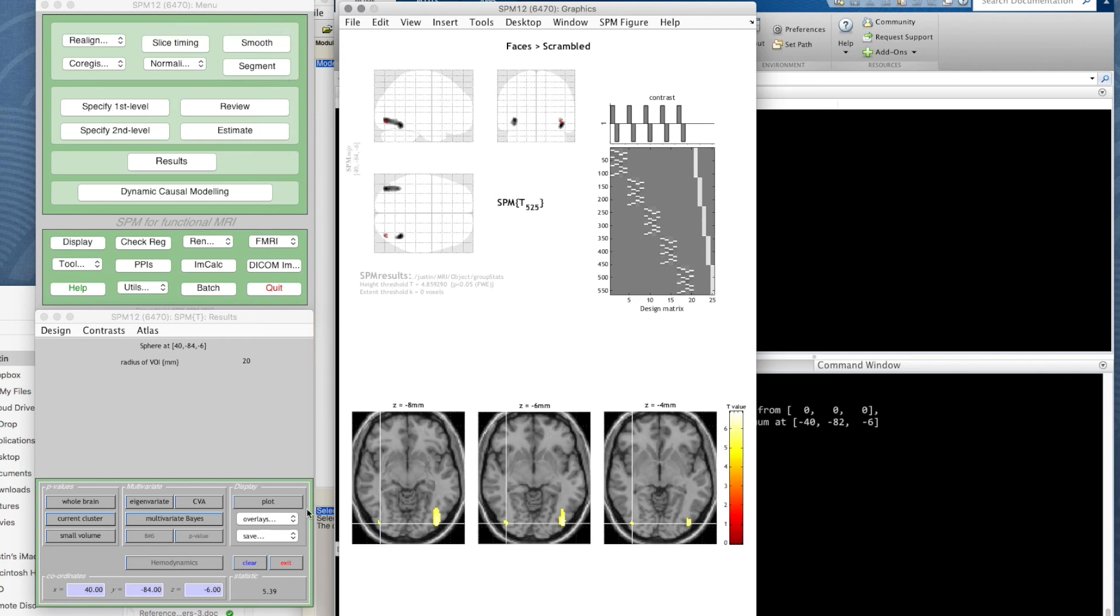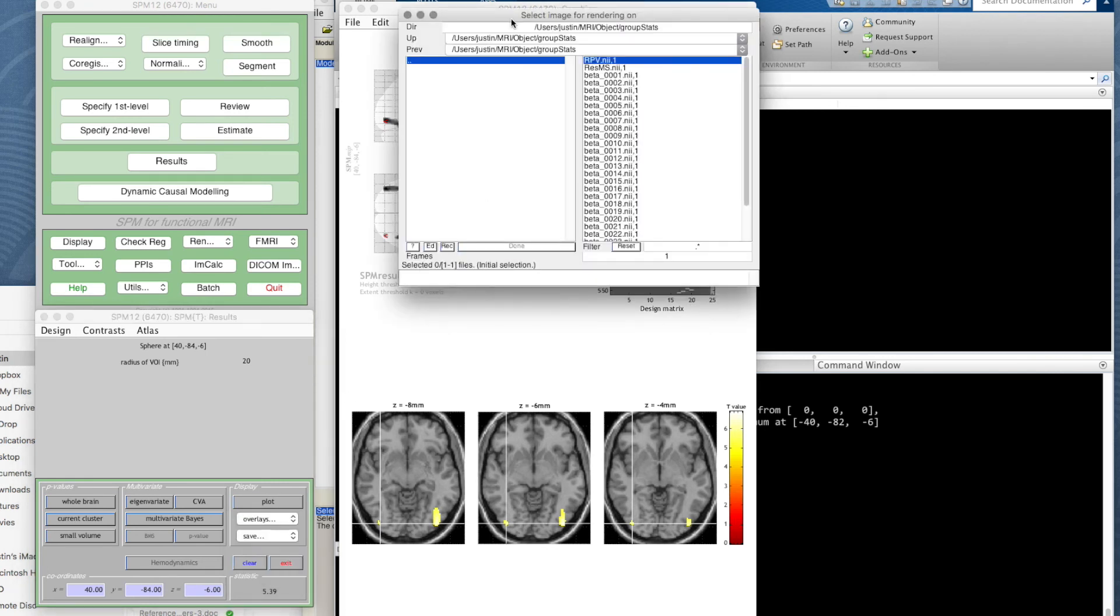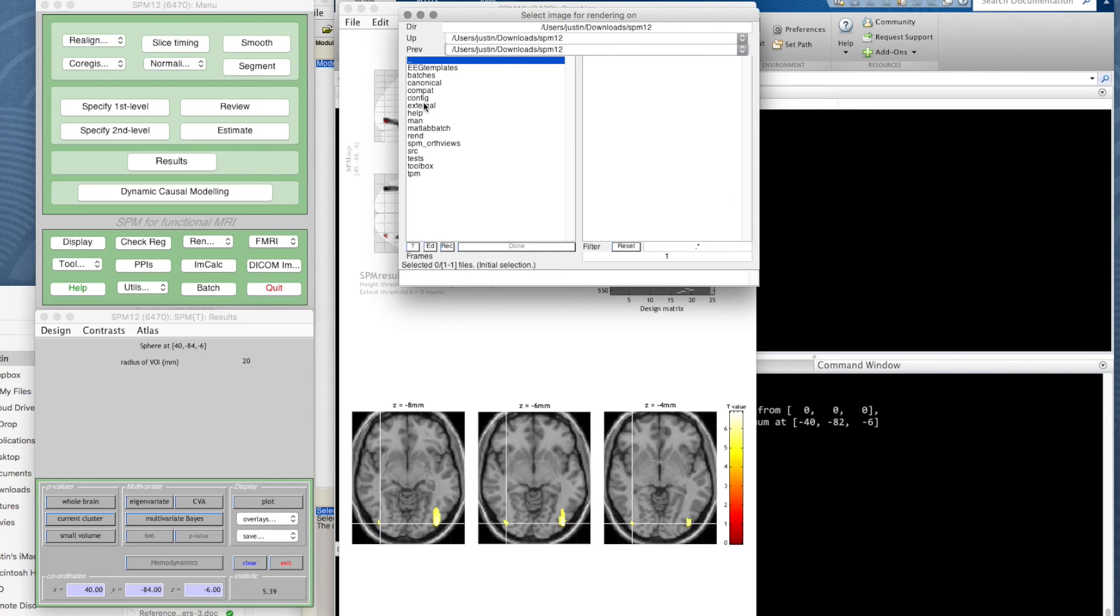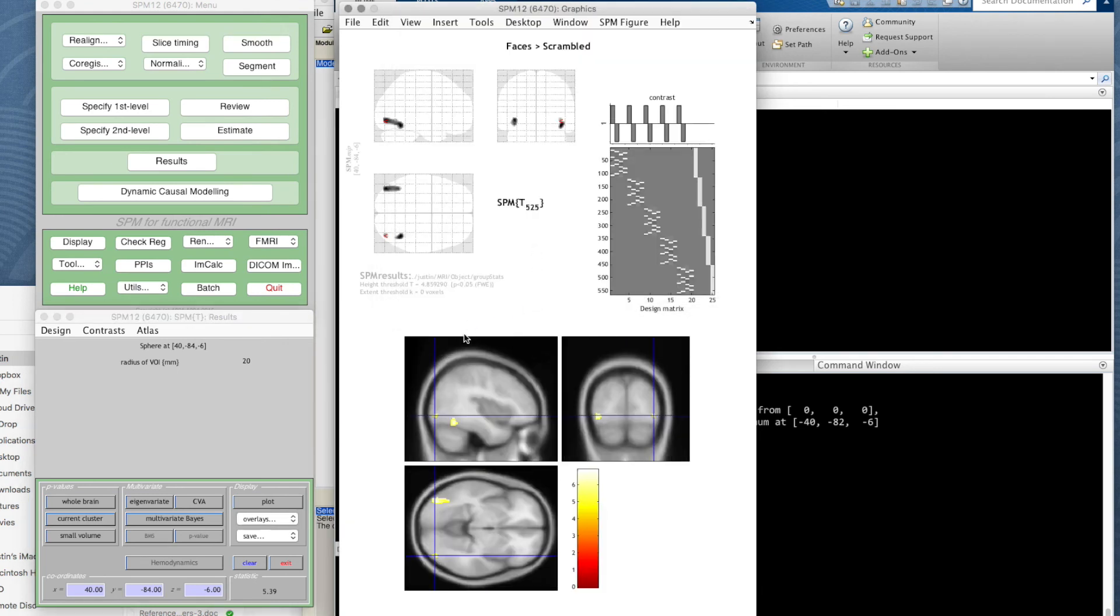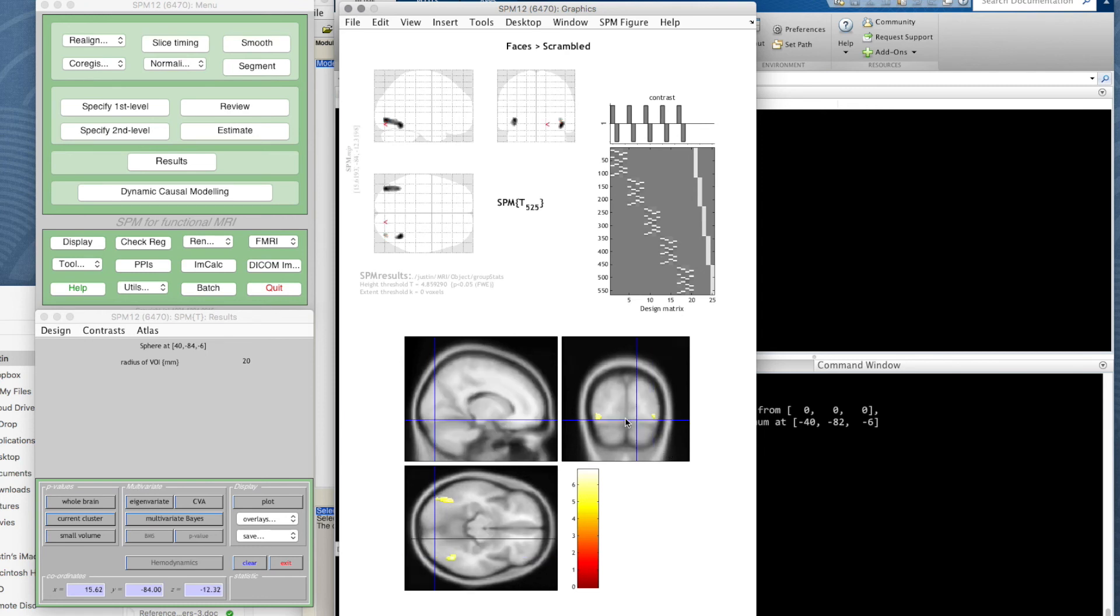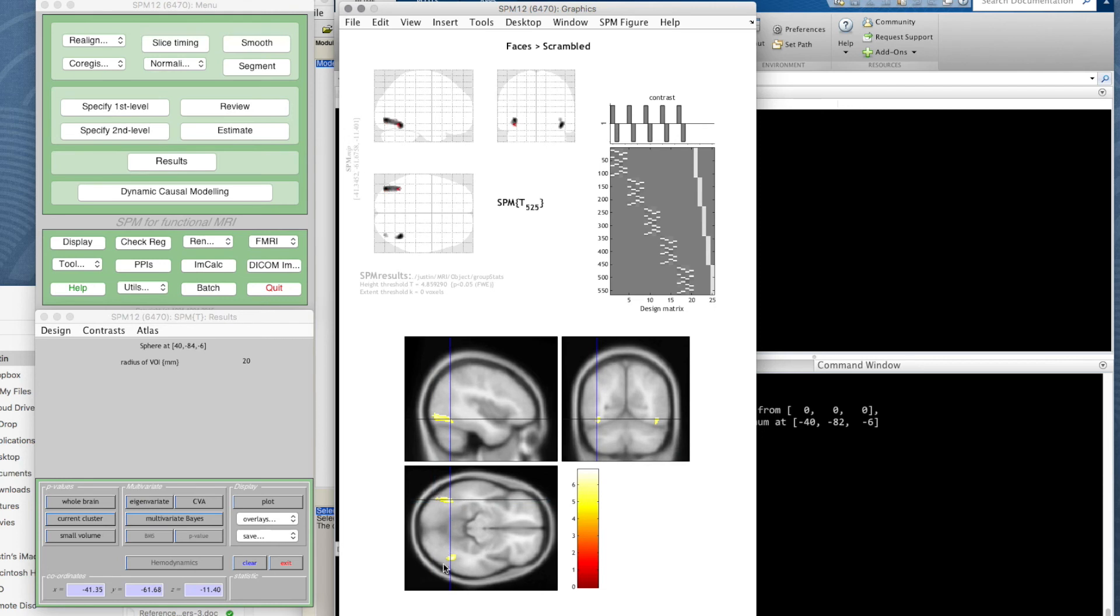If instead you overlay to sections, this time going into the canonical on the average of 152 people, this is more honest, but of course it doesn't help so well in localizing where your activation is in terms of boundaries between different regions. Note that unlike these slices, these sections are clickable, and so we can jump around in here and look at what we've got.